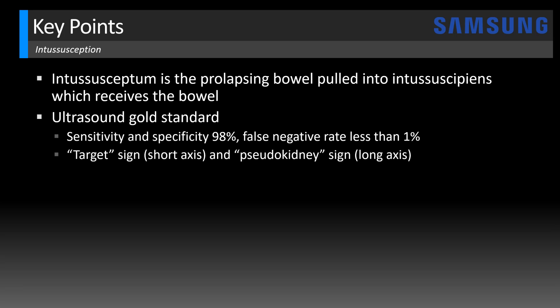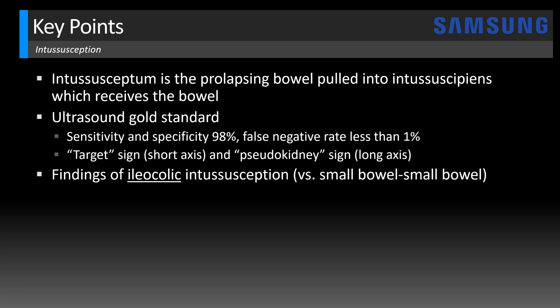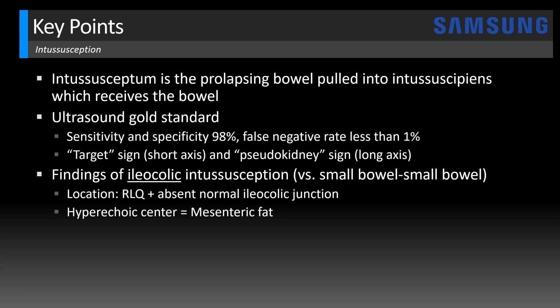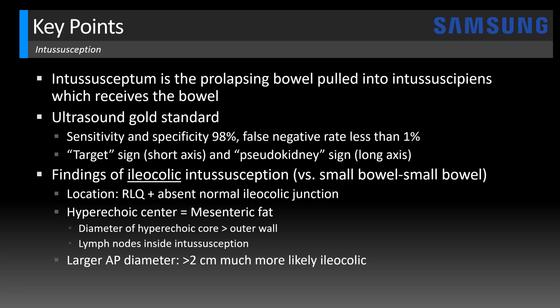Typical findings include a targetoid appearance viewed on short axis with concentric rings, and on long axis it may mimic the appearance of a kidney, yielding the pseudokidney sign. More specific findings allow us to differentiate ileocolic from small bowel-small bowel intussusception. The most obvious is location — ileocolic intussusceptions tend to occur in the right lower quadrant and we won't see a normal ileocolic junction. These also have a hyperechoic center representing mesenteric fat, and if the diameter of the hyperechoic core is greater than the outer wall, that's more suggestive of ileocolic type. Lymph nodes may also be included inside an ileocolic intussusception.